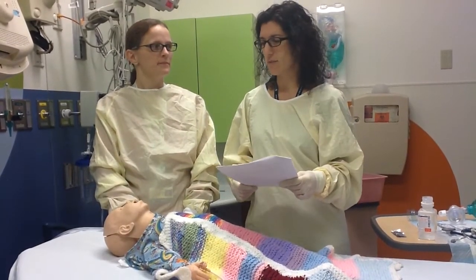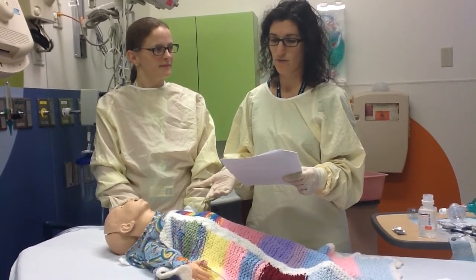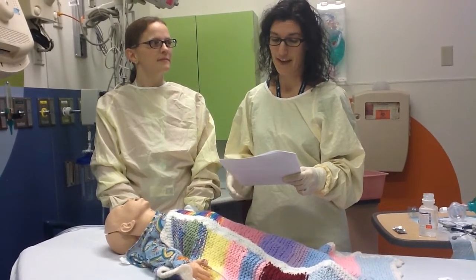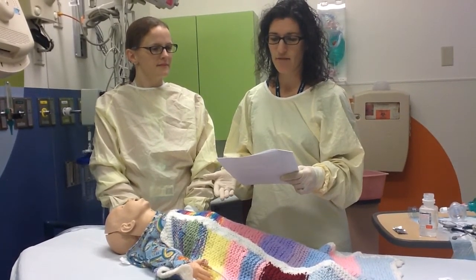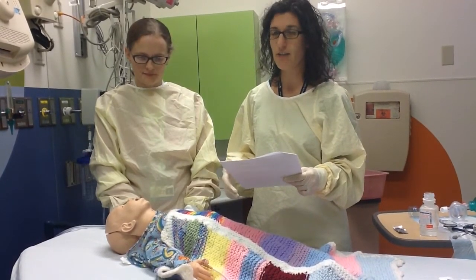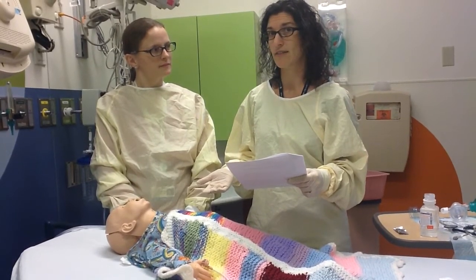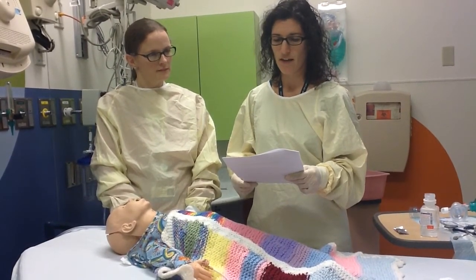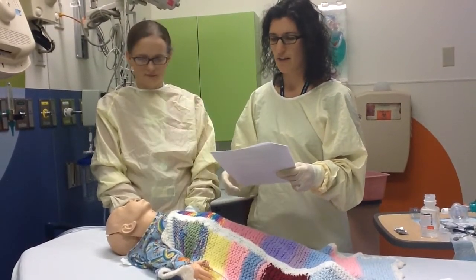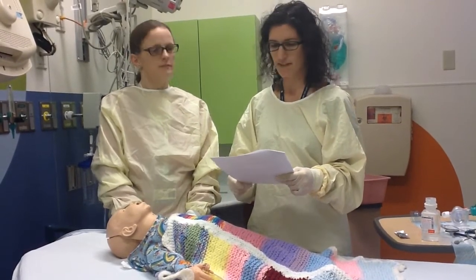The first thing to do is prepare the patient. That means explaining the procedure to the patient and or their family so that they understand and are as cooperative as they can be. Speaking calmly and reassuringly to the patient throughout the procedure is important, and for younger children, using visual distractions. That may involve inviting your child life specialist in while you're doing the suctioning. A visual distraction above the child's head can help, and they may look up further so that you have an easier time doing the suctioning.